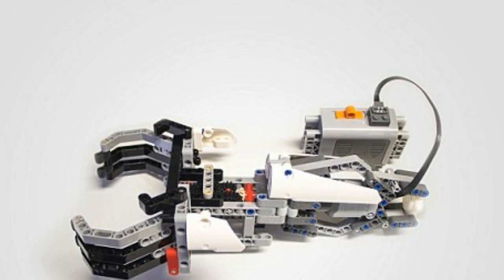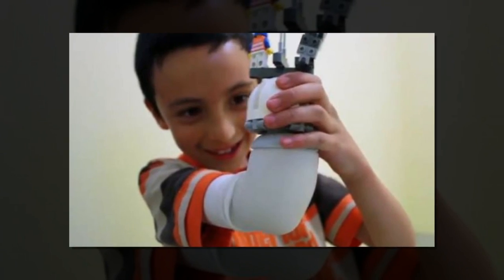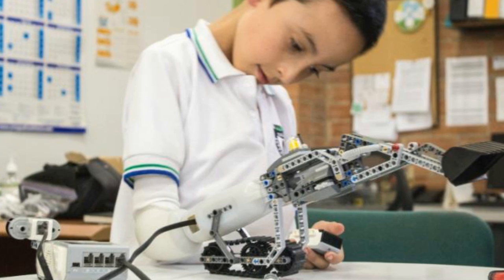Eco is a prosthetic arm that can be fitted with Lego bricks so that the wearer can take designing their own hand into their own hands. Prosthetic limbs are made more or less in the image of the limb they are replacing, but as many are discovering, they don't necessarily have to be.